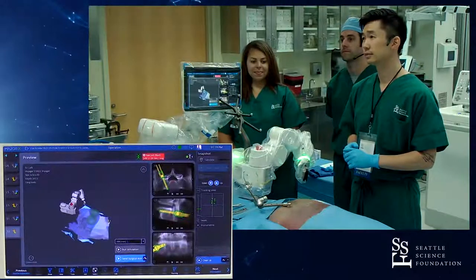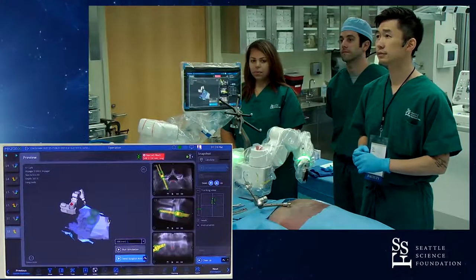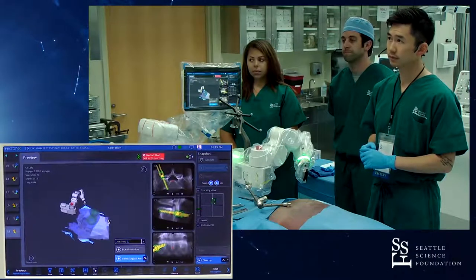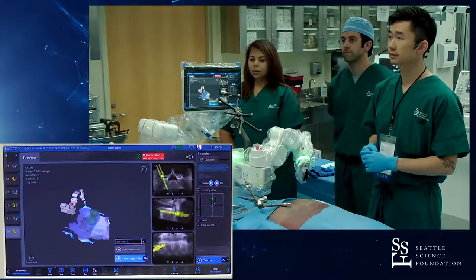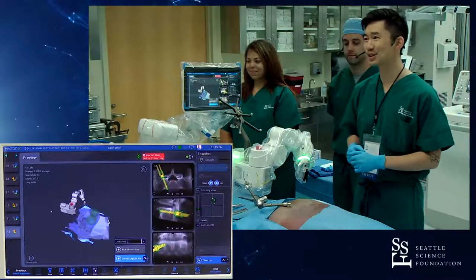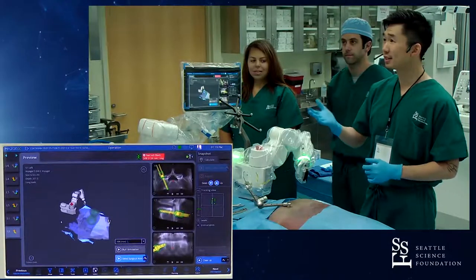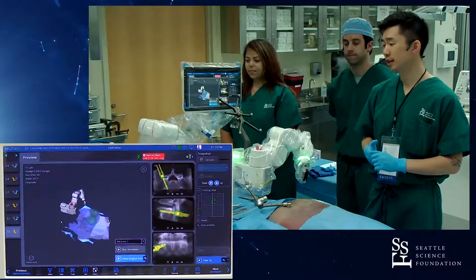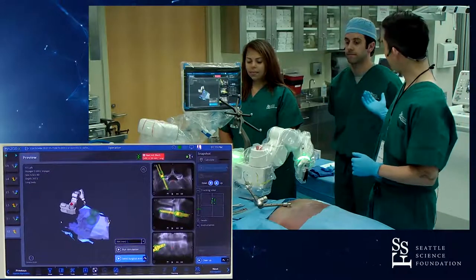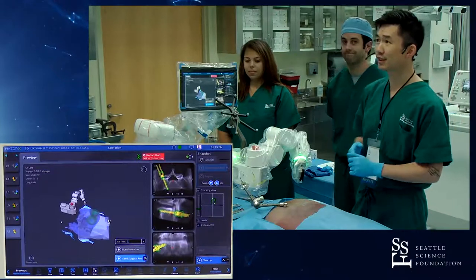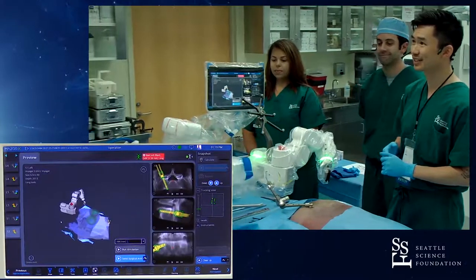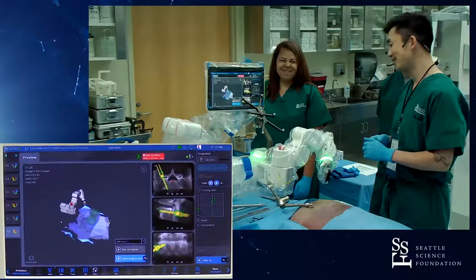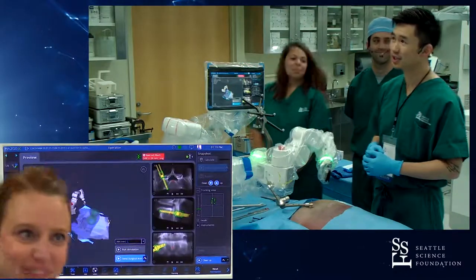Dr. Martin Pham is an assistant professor of neurosurgery at UC San Diego, and he's going to teach us more about robotic surgery. My name is Martin Pham, and I have with me Dr. Ben Schell, a phenomenal fellow this year at the Seattle Science Foundation. Kiannika Schmidt is going to be my scrub, and Sarah Harper in the back is going to be running the machine.